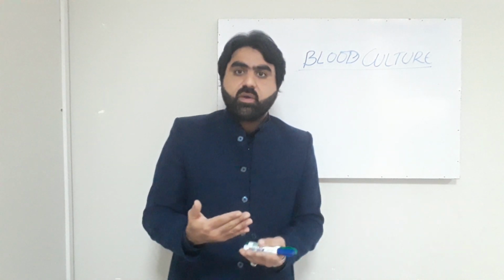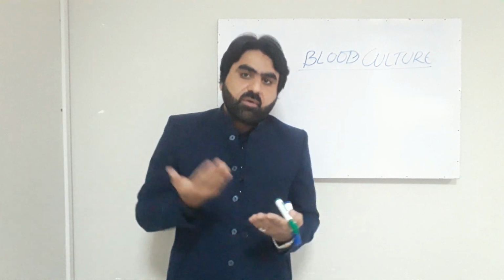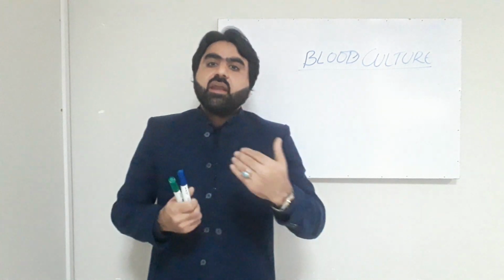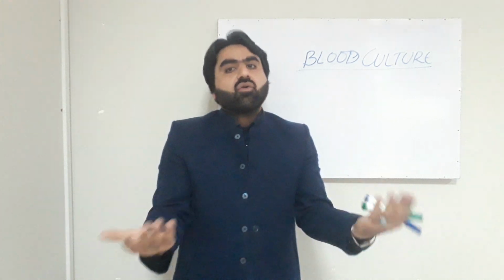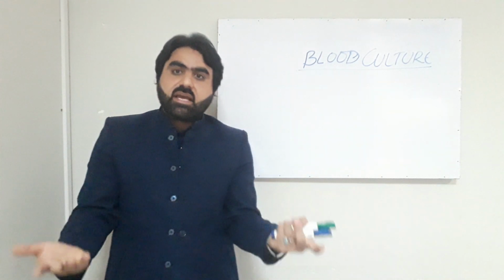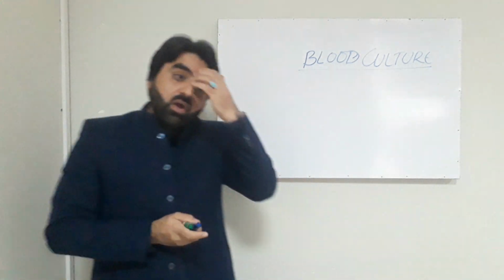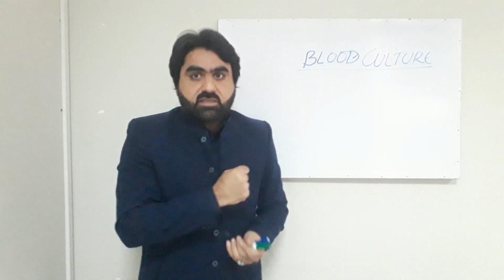After overnight incubation, we carefully examine the morphology of the colony and we perform different biochemical tests for the isolation and identification. If it is pure growth and it is a true pathogen, then we perform antibiotic susceptibility testing according to the CLSI guideline, as we have discussed in my previous lecture. Now a little about the interpretation of the blood culture.